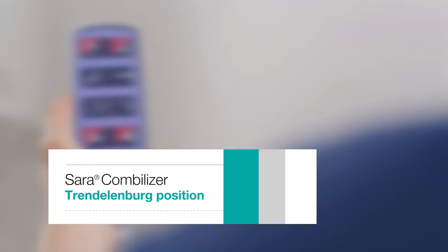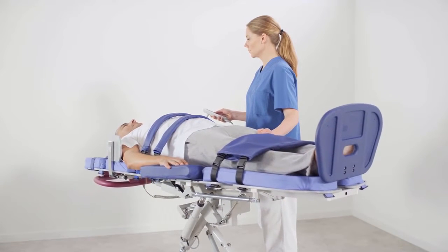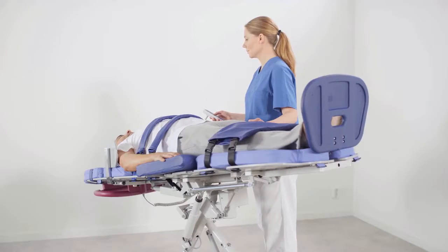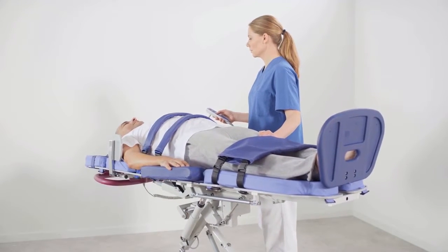To move the patient from a horizontal recumbent position to a Trendelenburg position, press the tilt back button on the hand control. The angle can be adjusted from 0 to -25 degrees. Press and hold the tilt upright button to return the patient to a horizontal recumbent position.